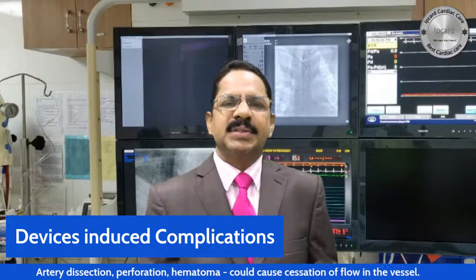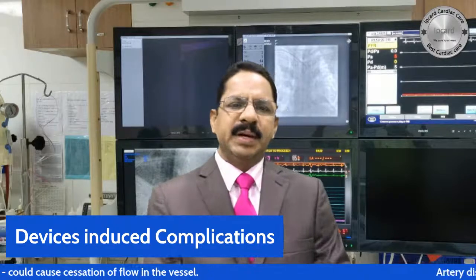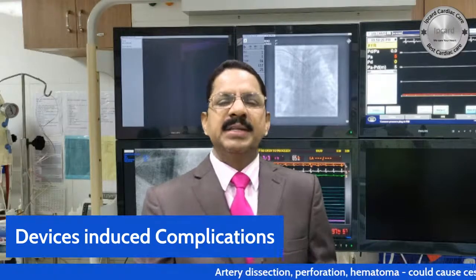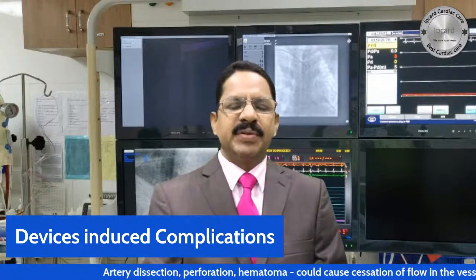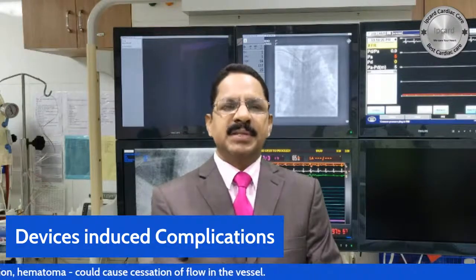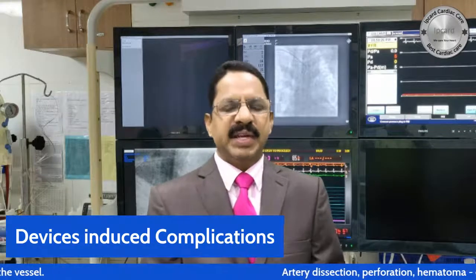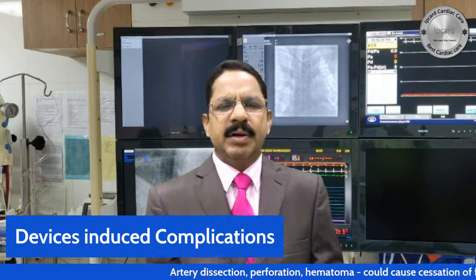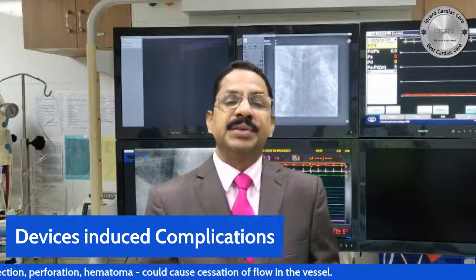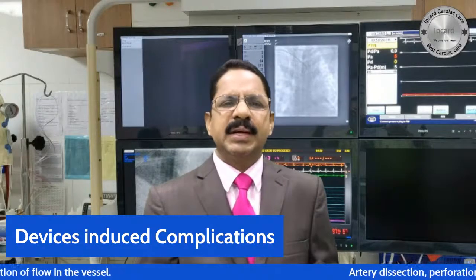So device related complications are very mild, like a perforation. Suppose the operator is performing a left radial or right radial angiography or angioplasty, even after the procedure, during retrieving and engaging the materials, the patient may get a mild perforation in the radial artery, and consequently the patient may develop compartment syndrome, like inflammation, swelling, and hematoma in the puncture site. Sometimes, very rarely, I have come across one patient, not from my colleague, I saw the patient developed an arterial aneurysm, a radial artery aneurysm, after angiography. That was something missed unknowingly. Unfortunately that incident happened.